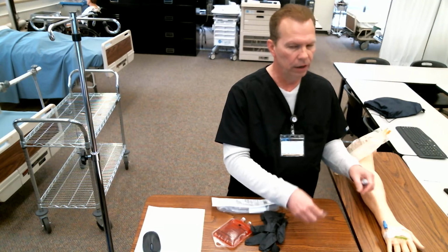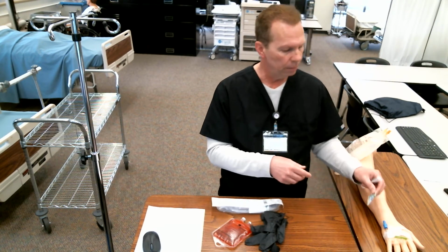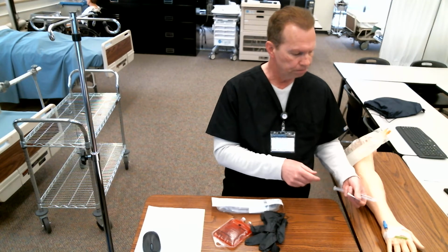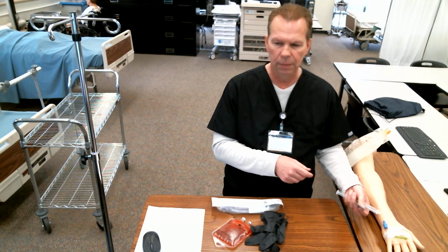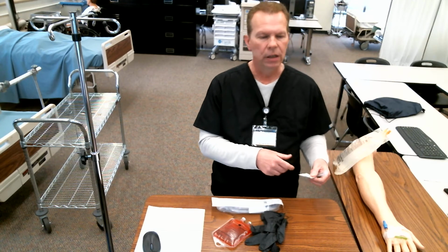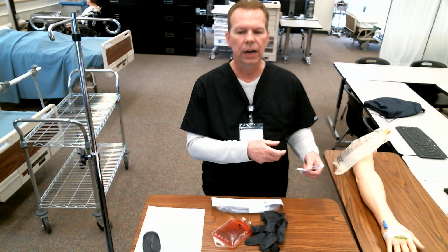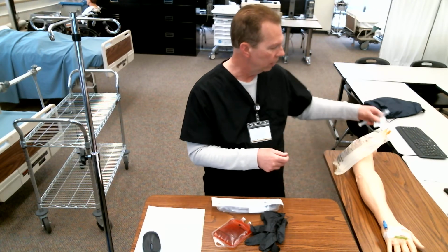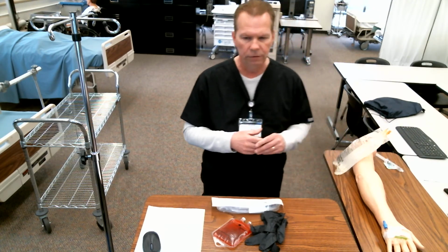I'm going to go in there, take my alcohol prep pad, swab off the Heplock, and check it, make sure that it is patent, that I can get some blood return there, I can flush easily, and all that kind of stuff. So we've verified that.